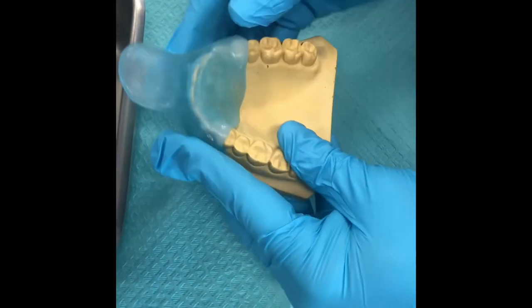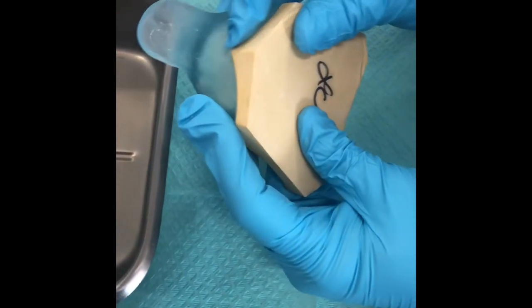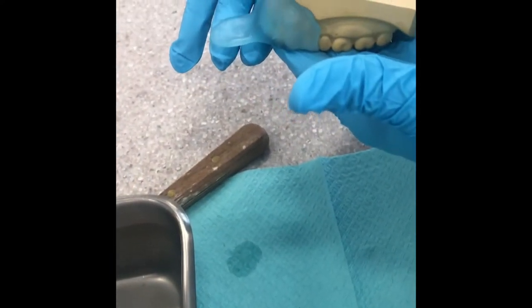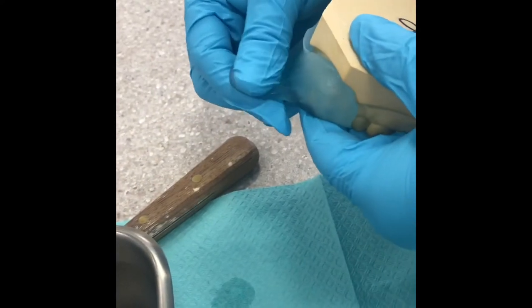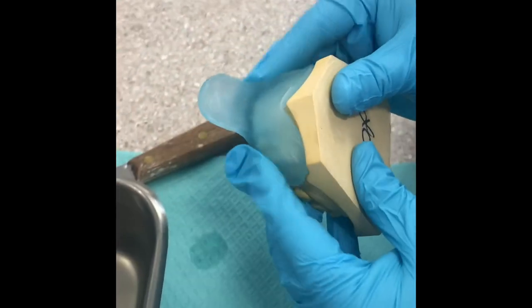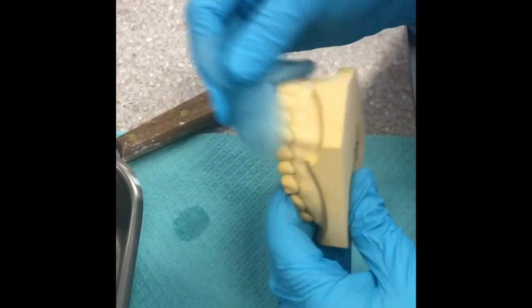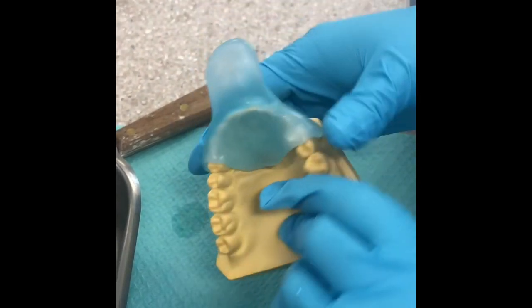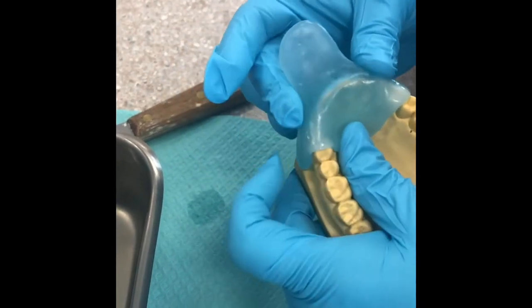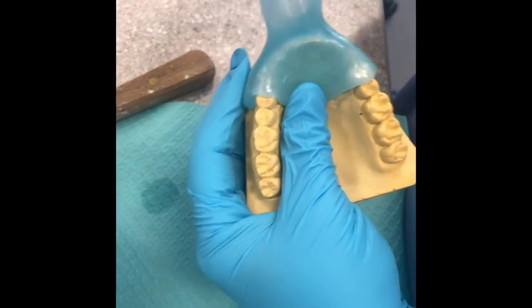So again: premolar to premolar, up onto the palatal area, up into the vestibule. The handle should be flat with the occlusal plane and wide enough to hang on to — about an inch or so. As it starts to set, try it on and off the model to make sure it's not locked, and watch for it to turn back to that opaque shade.